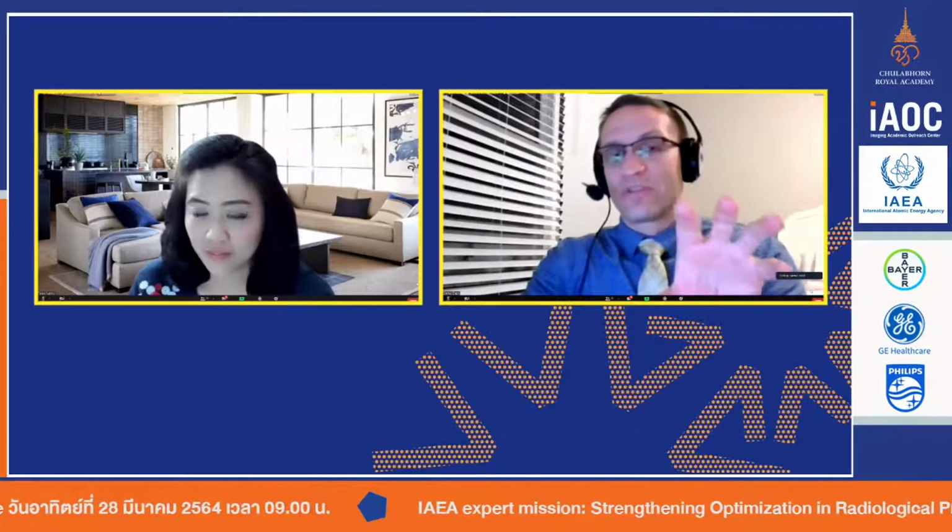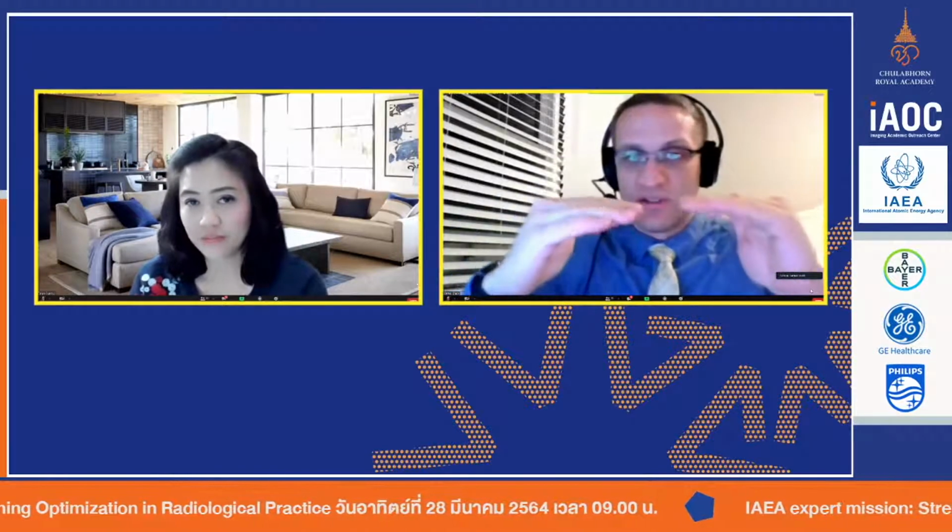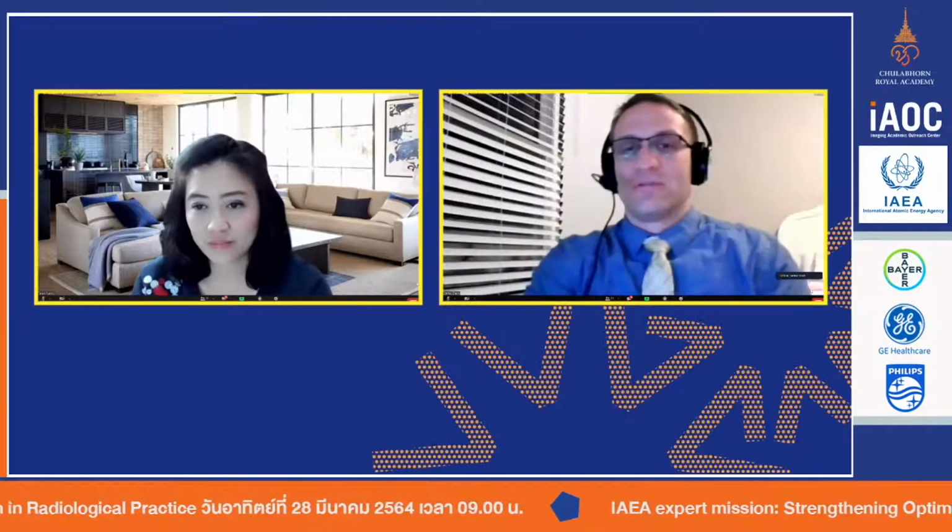So what we really need to do is develop the clinical application of dual energy outside of stones, uric acid, et cetera. Is there room in oncology for dual energy? Is there room in cardiology for dual energy? And that hasn't quite been developed. As we answer those clinical questions, that's when you'll see dual energy used almost always. And that's where, as you start collecting all of this dose data, it'll be very helpful, because you'll already have some levels of data so you can set your DRLs in Thailand.